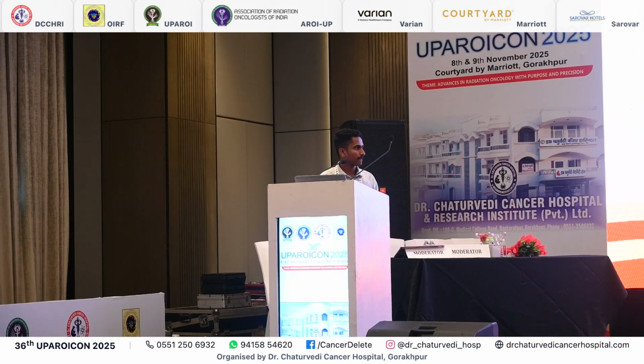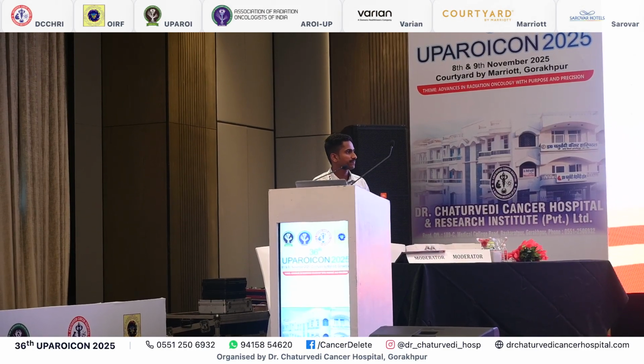It will be insignificant at the isocenter, but at the surface it will not be. Yes, sir. So what is a good dosimeter to measure the surface dose? Because you used only ion chamber measurement, is that right? No, sir. I used film also for surface dose measurement, EBT3 Gafchromic film, and the bolus was kept above that. But nanoDots may be a better idea to use, because again there can be surface air gaps and other things. Yes.